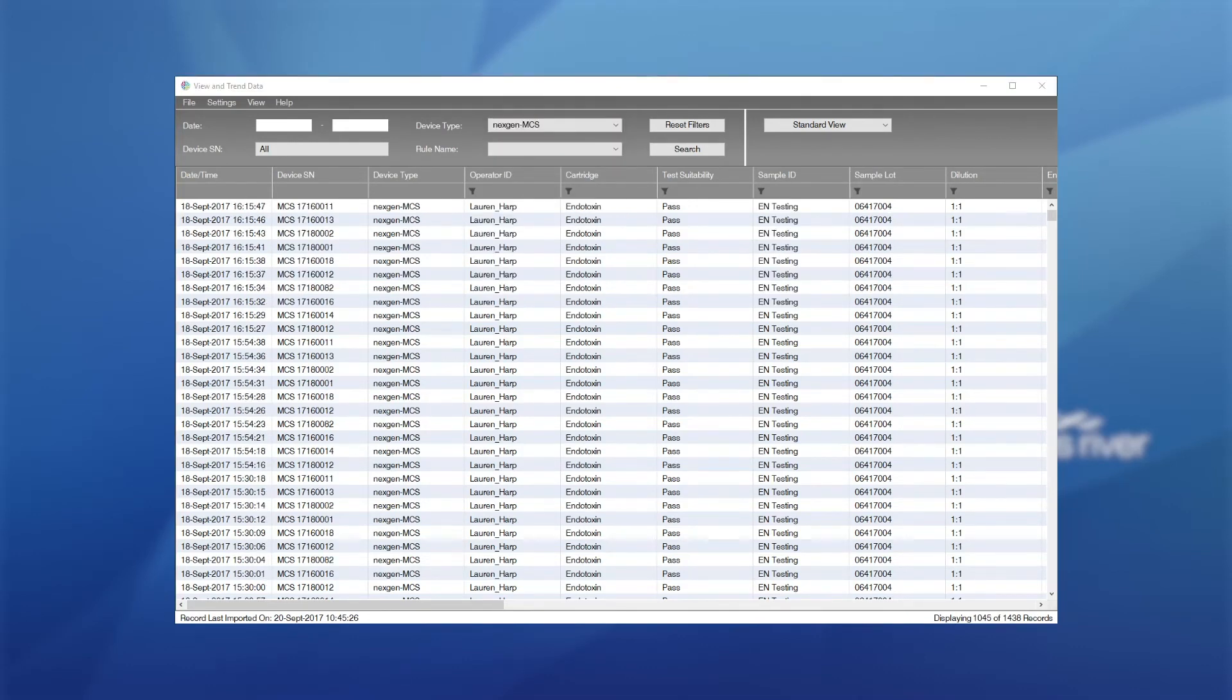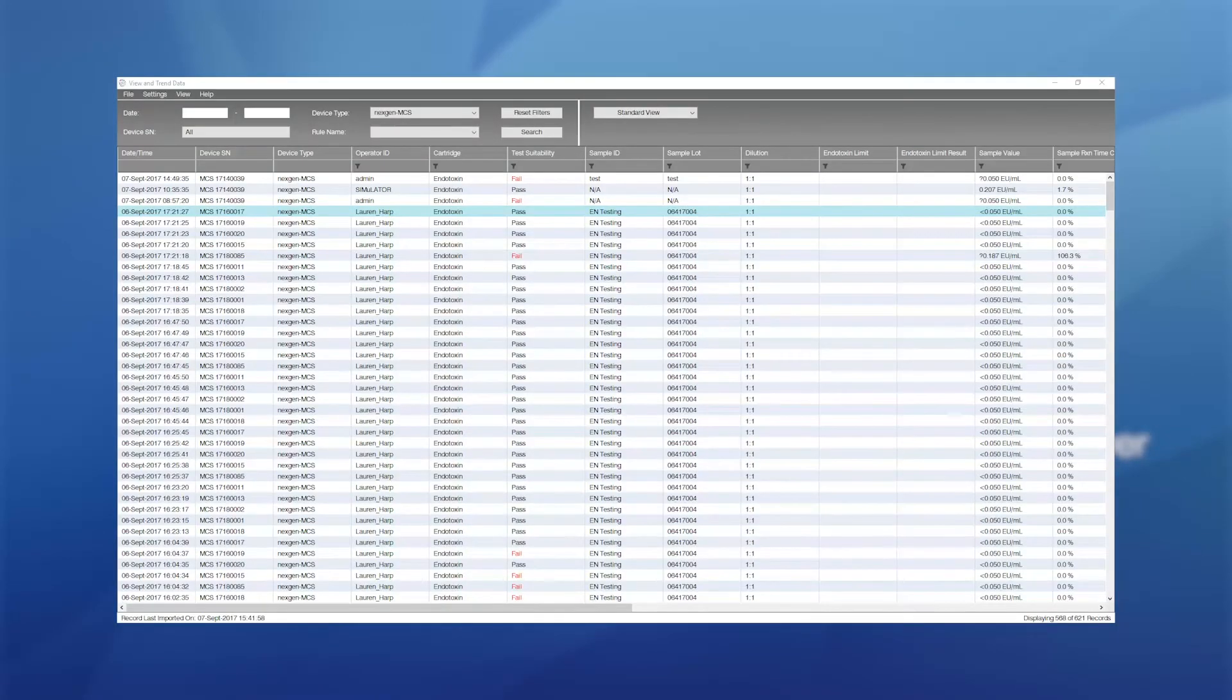You can also use the date filters in the section to filter data down to a specific day. Once data has been filtered, select the assays required and right-click on them in the main view screen. From here, the user can print individual reports, summary reports, and apply electronic signatures.